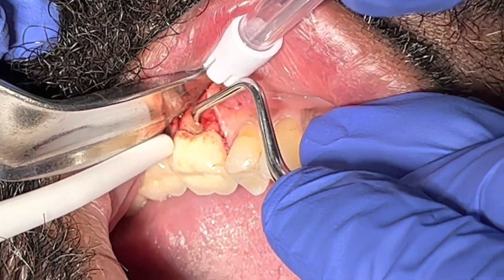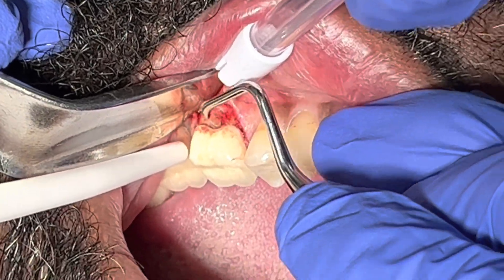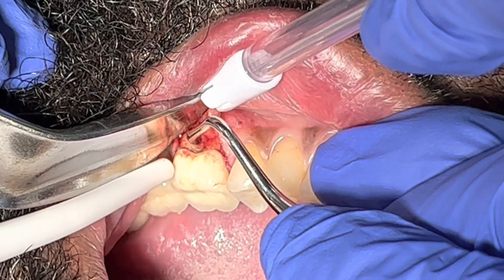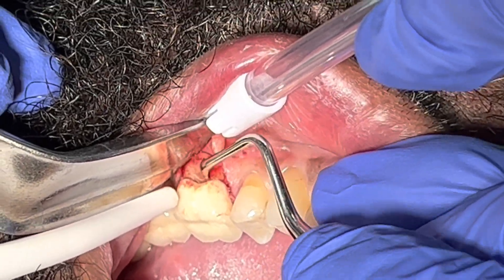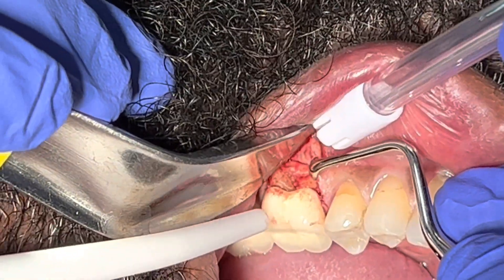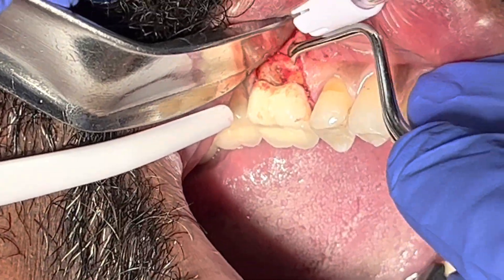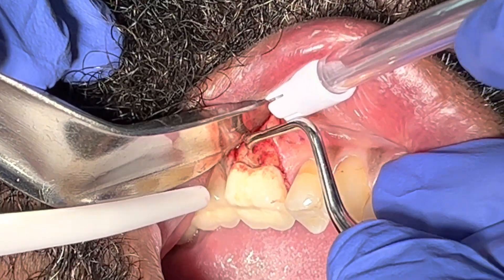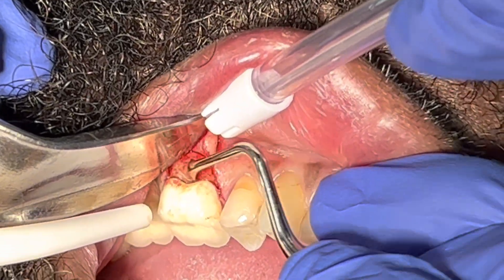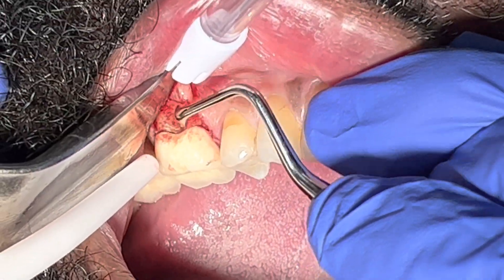I'm going to show you the interesting decision I make after I clean everything up. I'll continue to clean and disinfect this tooth really well to get it ready for grafting. I was preparing a particular bone graft for his care. Everything seems to be on the right track — the bone loss is right at the furcation point, and the alveolar bone architecture appears more diminished on the distal root compared to the mesial root.